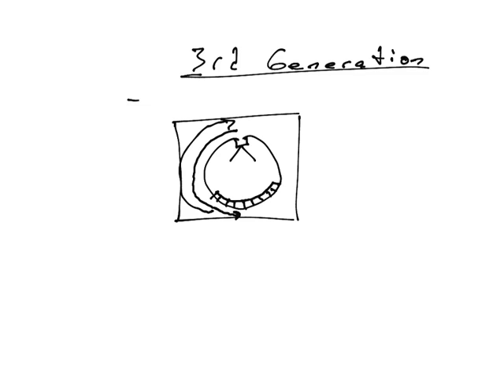So now you didn't have to slide the beam across and then rotate a little bit and then slide it across again. Now it's purely rotational. You're just rotating the beam around. You have this whole series of detectors. Now you're down to basically doing each slice in about half a second. Now we're really getting quick. And computers were working very fast at the time. And so, like I said, you'd get about 2 pictures per second in this type of thing.